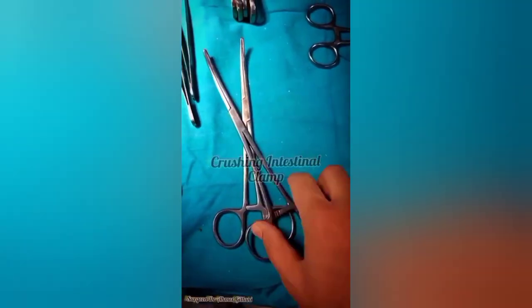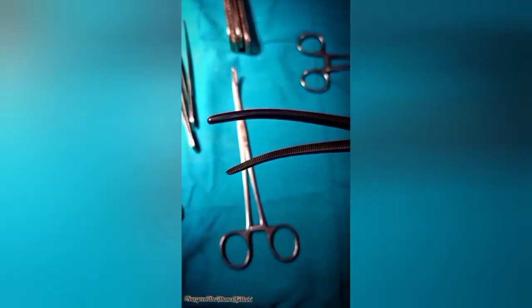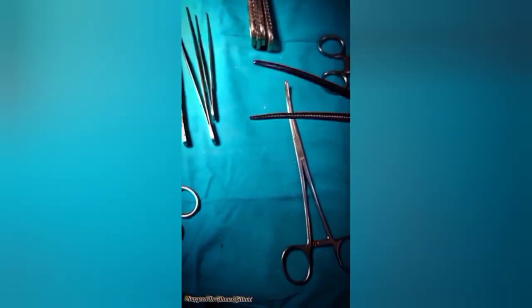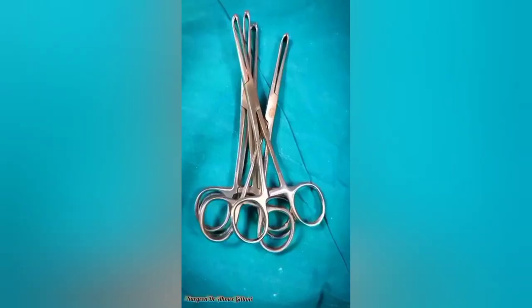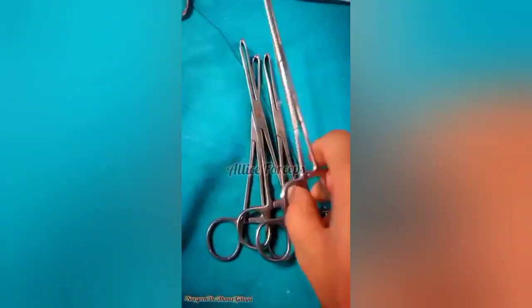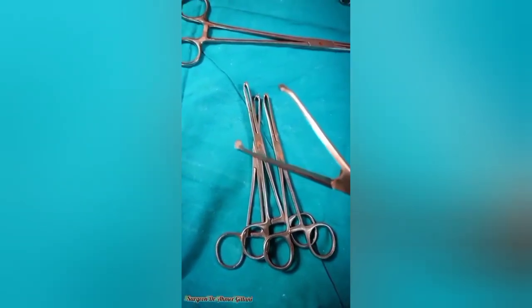Then we have the crushing intestinal forceps. In close-up view you can clearly see the cross-lines on its edges — it is the crushing category of the intestinal clamp used in resection and anastomosis. On the screen we also have the Allis forceps — a surgical instrument with sharp teeth used to hold or grasp heavy tissues, fascia, and soft tissues such as breast or bowel tissue. The sharp teeth are clearly visible at the end.